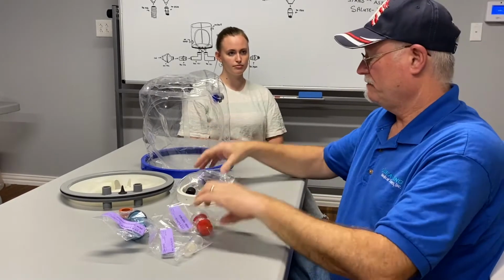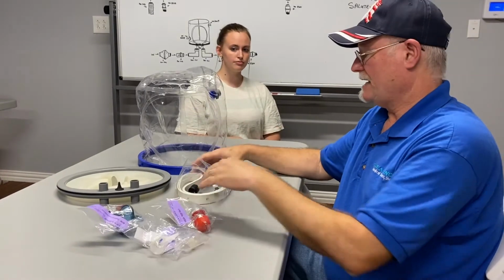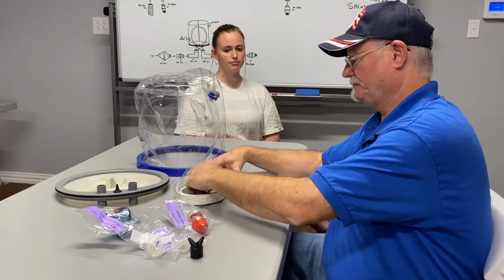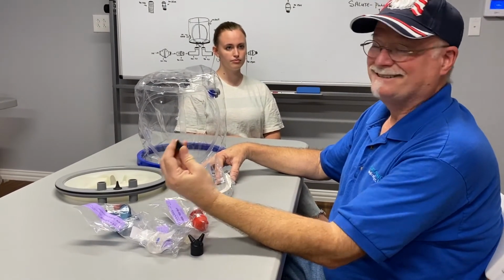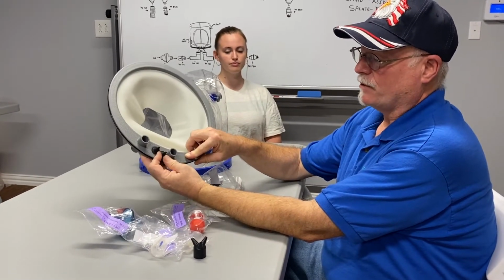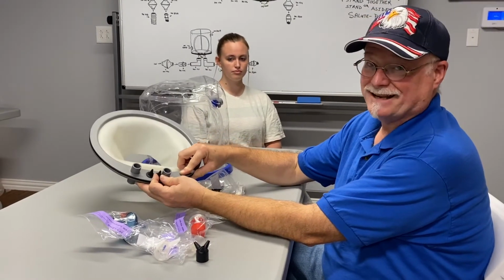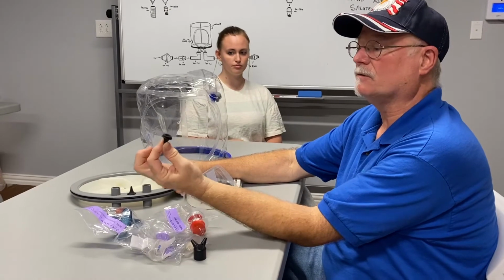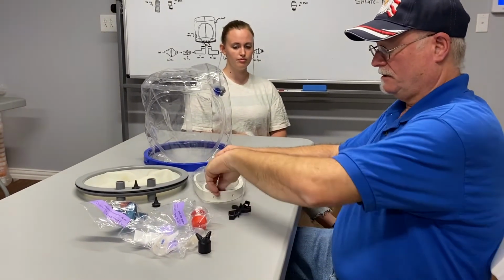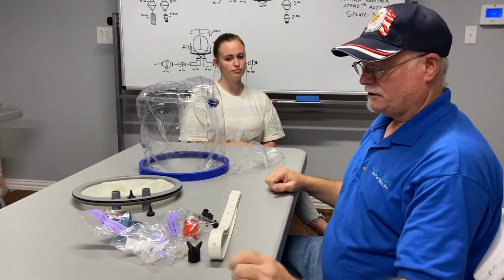The PEEP valve, another directional adapter, the multi-line adapter, the included second accessory port. This is used on the neck seal to provide a port for feeding tubes, liquid. You can administer medications, a lot of different sources, so you can have a different one. The hood clips and the hood straps.